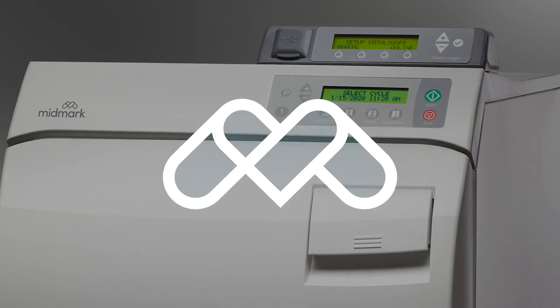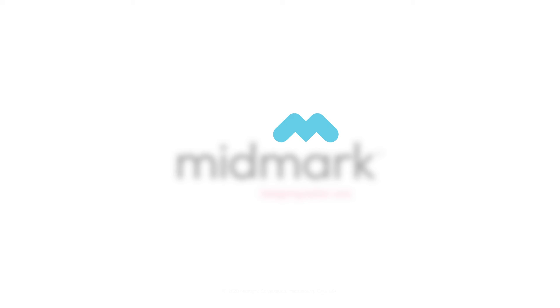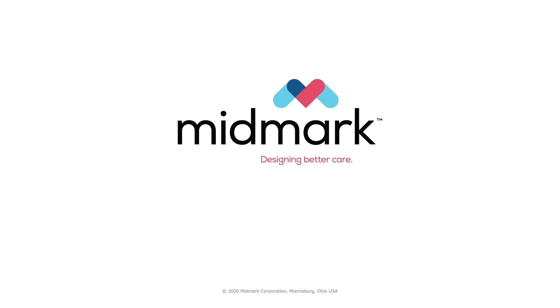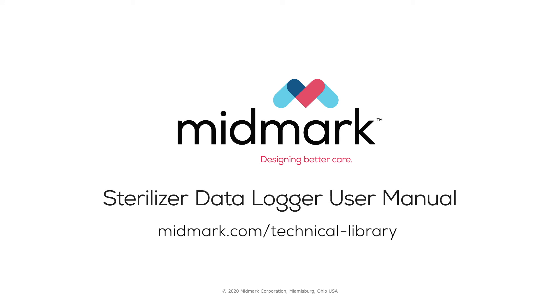For more information about registering your device, please see the sterilizer data logger registration video. For more detailed information about your device, please refer to the sterilizer data logger user manual.